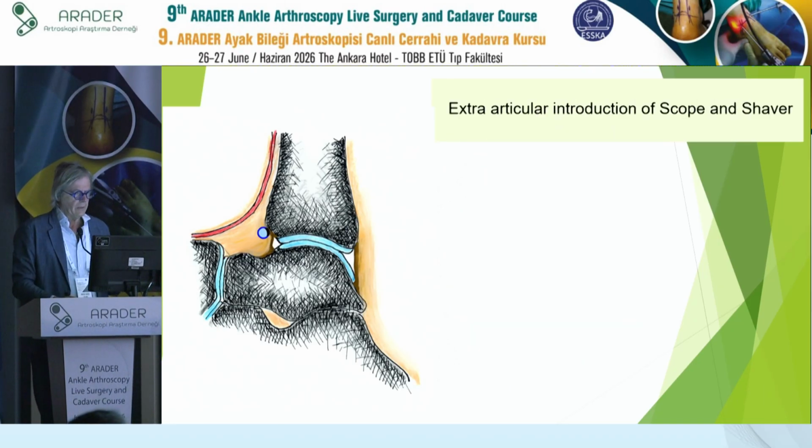That's a technique. So you go in, blind shaving, but because of the dorsiflexion you cannot damage the cartilage, and then you continue always with the opening of the shaver towards the joint, never towards the neurovascular bundle. And now you created your anterior working area.